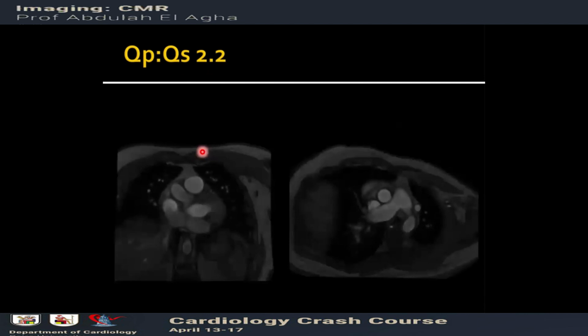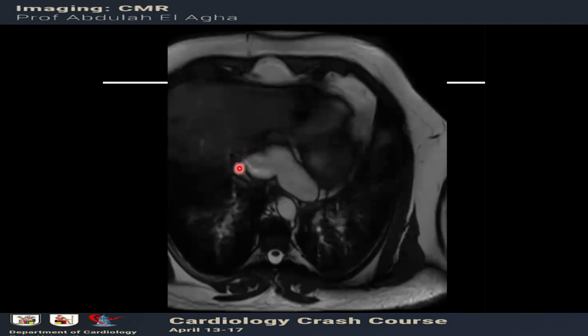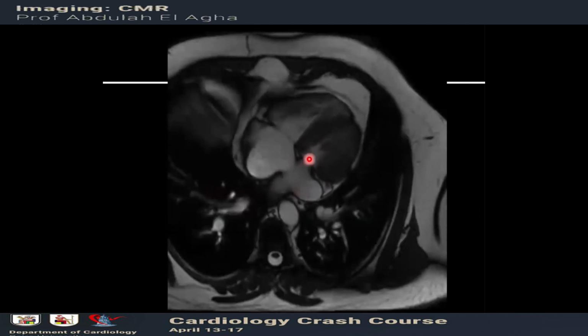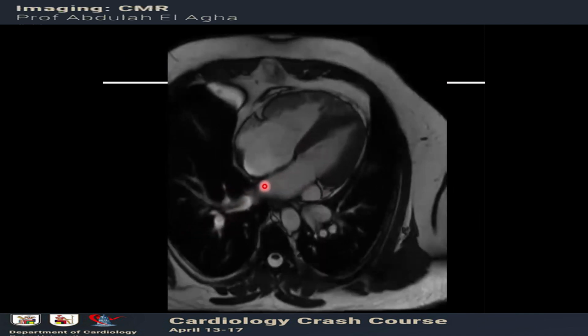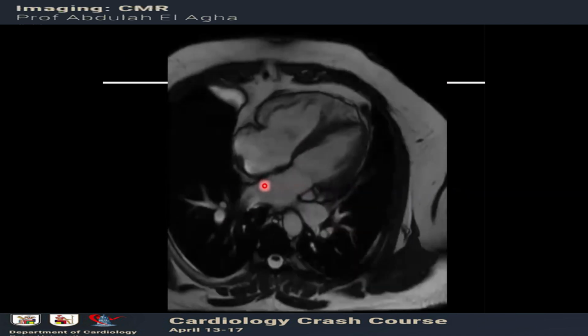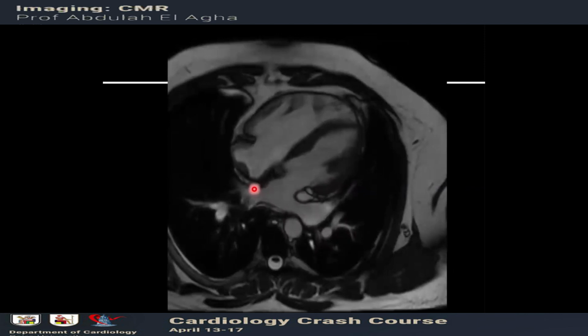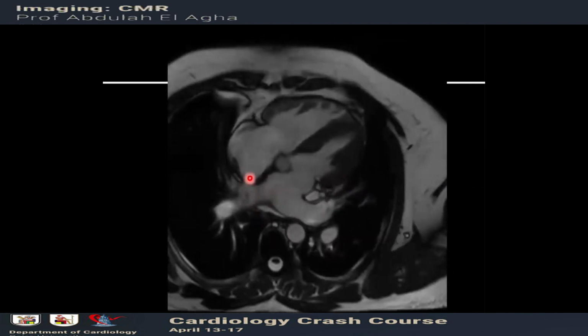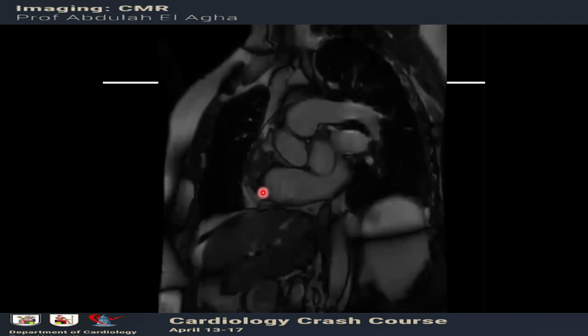The reason for the SVT, he doesn't need ablation. He needs to find the etiology of this dilatation. And what we found is a defect in the interatrial septum. It's a large defect, but sometimes it's difficult to find, even by echo. That's why it was missed by echo. You need TEE to find it, because it is a sinus venosus. There was a sinus venosus ASD, as you see here, with partial anomalous pulmonary venous return. We look at it by different views.